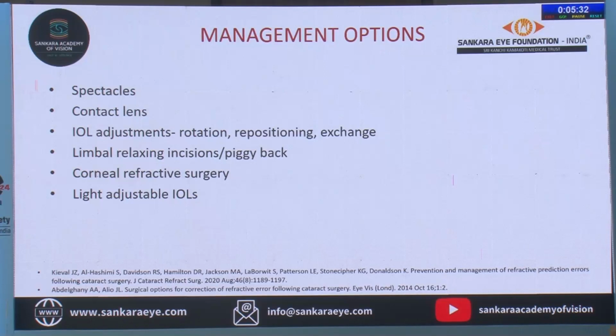IOL adjustments, rotation, repositioning, yes, in some cases of toric lenses may be necessary. That's a different topic, we will not be talking about it. Limbal relaxing incisions are more or less out, we don't do them, though we tried a lot, including with the femtosecond, but mostly it is all coming back. It is only for academic purposes.